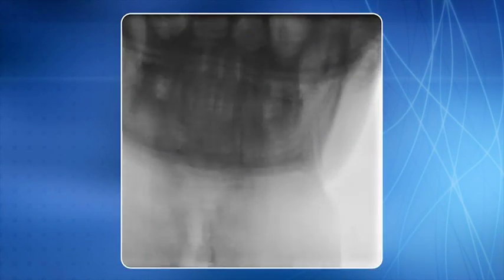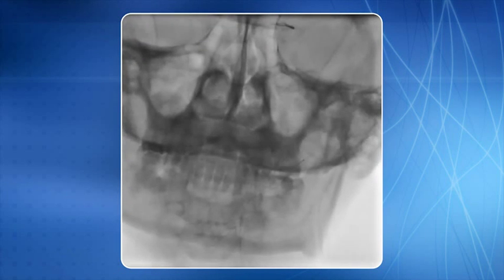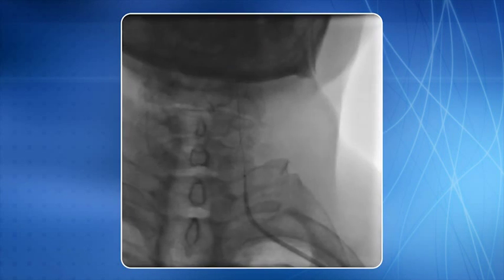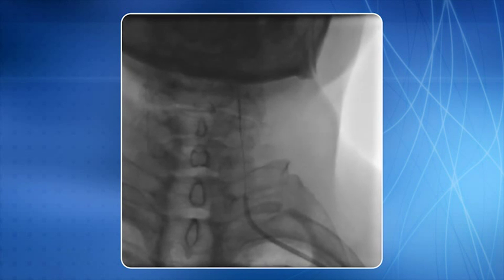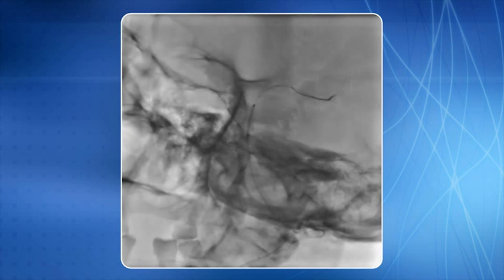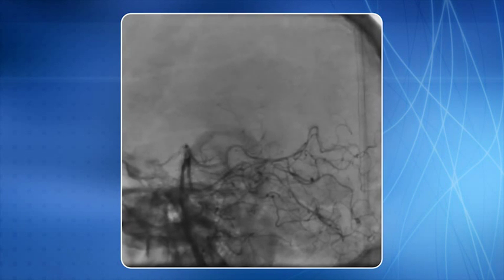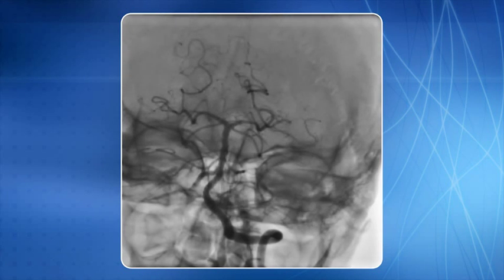Next day the lesion was stented in the usual fashion to avoid hyperperfusion brain injury. The stent was negotiated across the lesion and stenting was performed. The final result is demonstrated, and another view also confirms the satisfactory result.